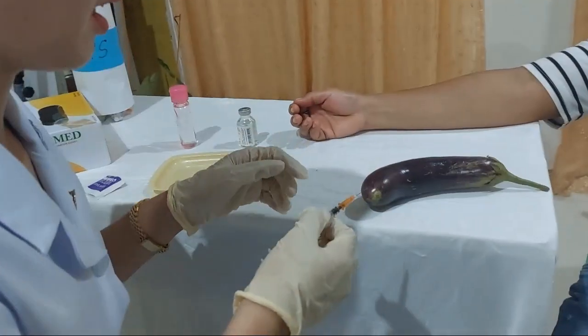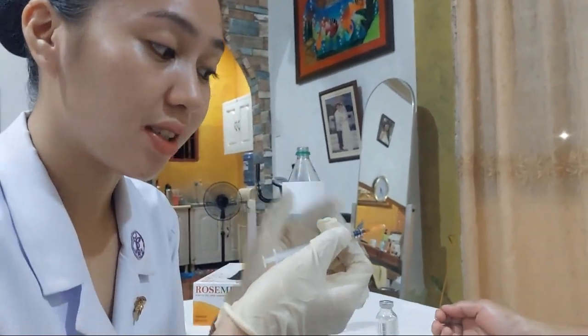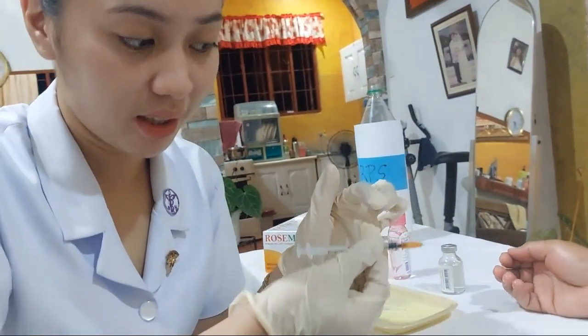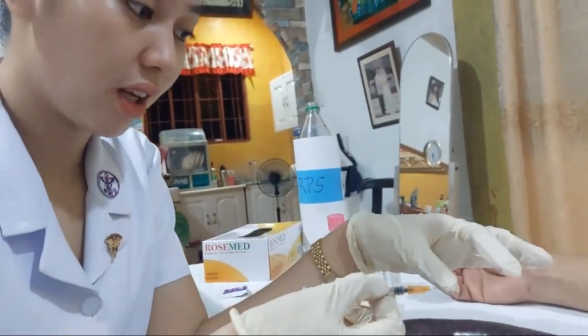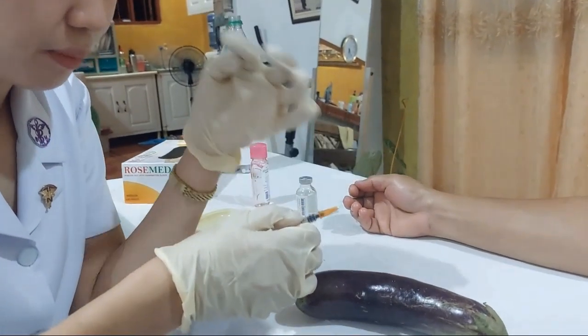You can see that while I am injecting for the intradermal, we have to stabilize our hand. So I hold the syringe by the barrel closer to the top with my dominant hand, like this, with my thumb and index finger, and my non-dominant hand, as you can observe earlier, will do the stretching. I'm going to demonstrate that, and the bevel is facing towards me.